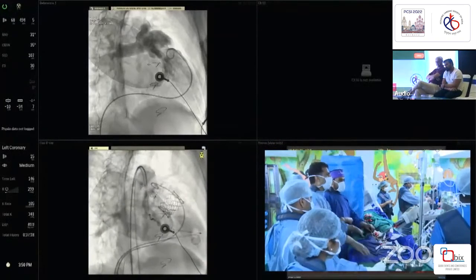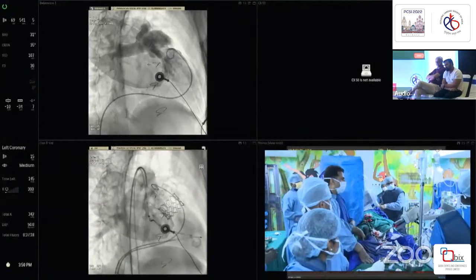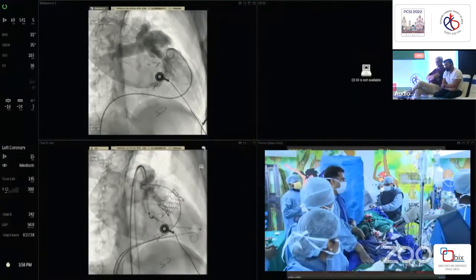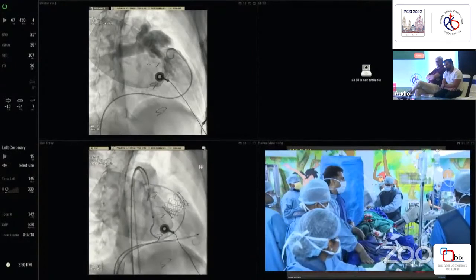Okay, that's the result, guys. Great, nice. Good result. Very stable valve. Okay, congratulations. Good result.